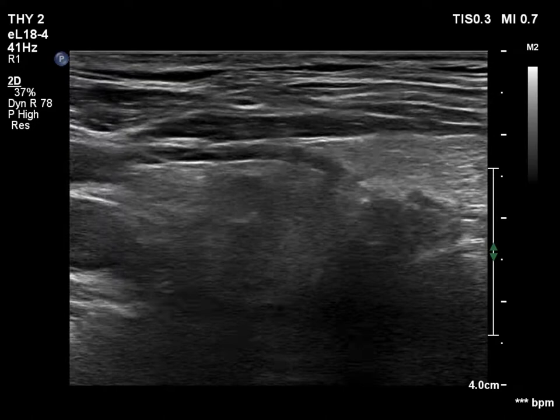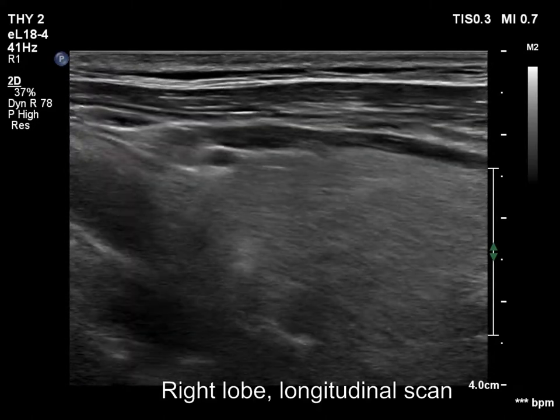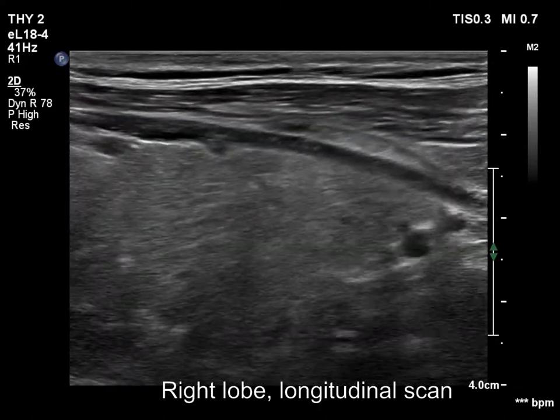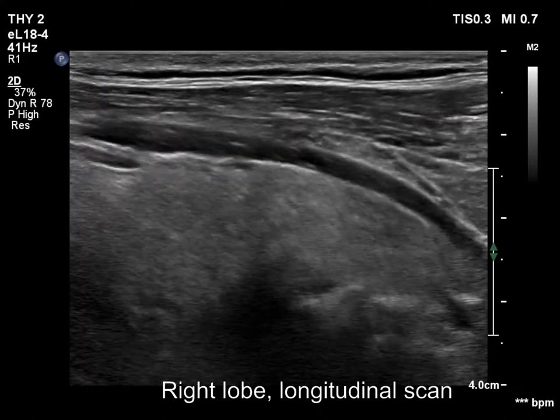The right lobe is echonormal and a bit inhomogeneous. It has no discrete lesions of any importance.